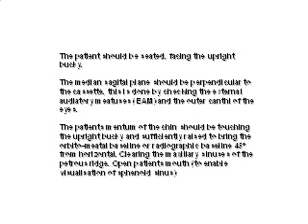The head should be so extended such that the orbitomeatal baseline or the radiographic baseline is at 45 degrees from the horizontal. Now this is done to clear the maxillary sinus from the superior border of the petrous pyramid.